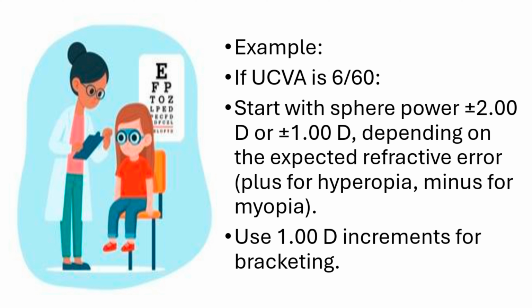And whenever we are ready to test the patient's uncorrected visual acuity, for example 6/60 or 6/24, or even counting fingers or hand motion, we have to remember: first the starting sphere, second what to add, and then proceed with the cylinder test if needed.